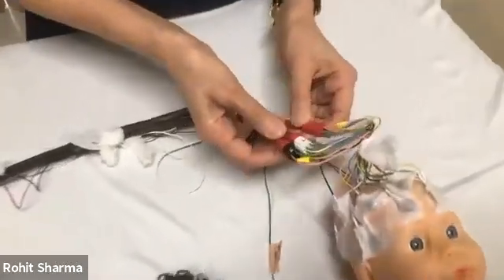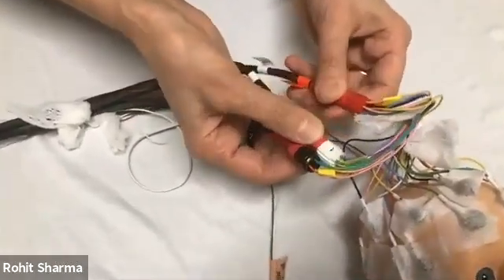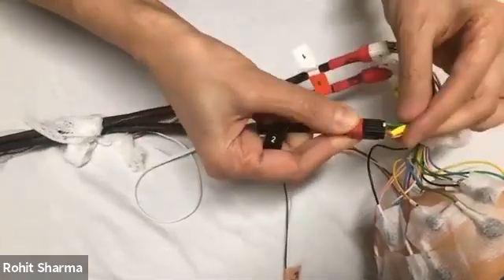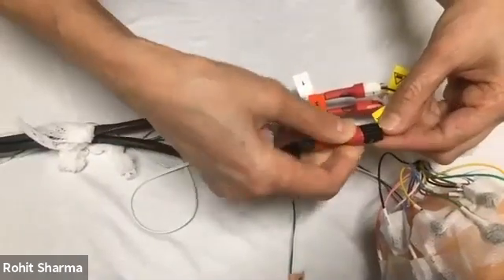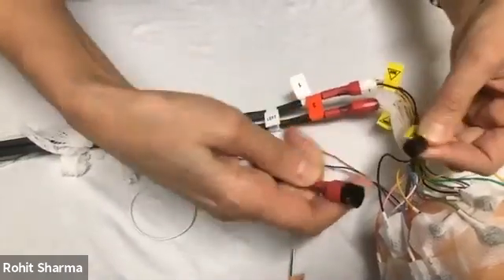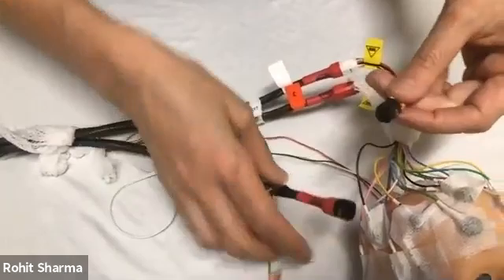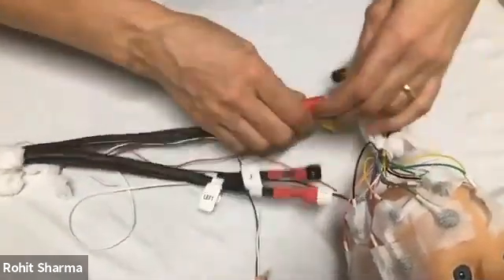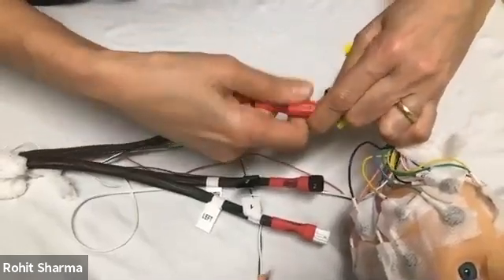Then you notice that there's 3 tails here. It says 1, 2, and 3. And if you notice at the tails, there's a little yellow button here. If you press that, what happens is it disconnects from the patient. So you'll disconnect these 3 and you can just put them aside.